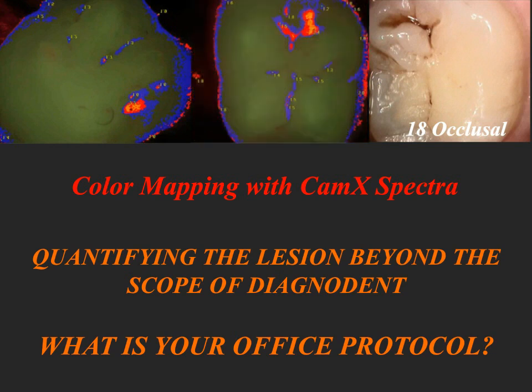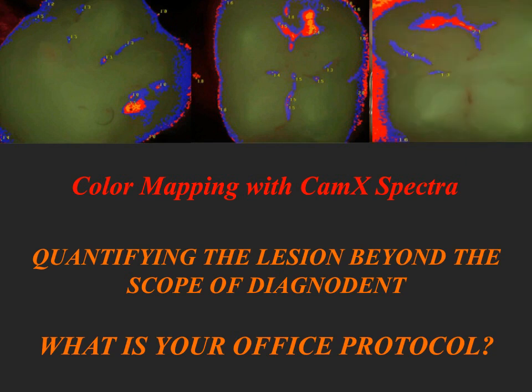Here's deep dentin decay in, I don't know whether this is mesial or distal, but it's the proximal pit of that molar, and some early enamel decay in the opposite end of the occlusal table. And when we look at the slide on the right, we can see definite deep caries there.